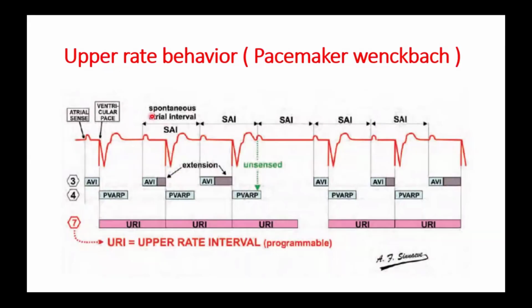so that the heart rate doesn't fall suddenly. Most importantly, the upper rate behavior occurs until the total atrial refractory period. As once the atrial rate is higher than the total atrial refractory period, 2-to-1 conduction occurs immediately.